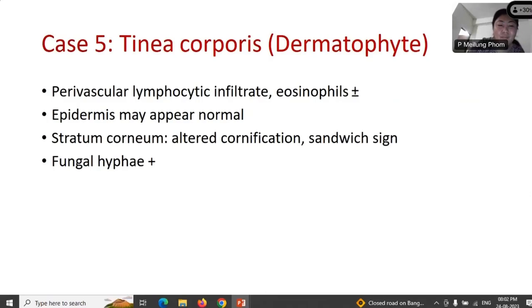Dermatophytosis is very common in our country. Compared to that, very uncommonly it is being biopsied. But when it is biopsied, at least we should diagnose it. So it's excellent that Dr. Rajalakshmi is doing PAS stain for every inflammatory skin disease biopsy. I think that's very good.